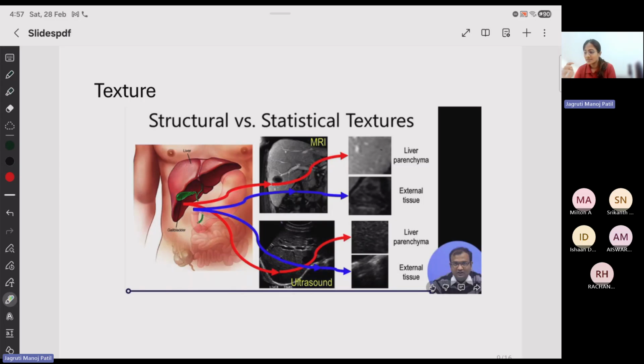Now all of these imaging modalities will conventionally give you grayscale images, right? So everything is in gray levels, in gray color. It's not that you can't change the color bar, but that's how people have conventionally used it, and that's how it is easy for the clinical instruments. Otherwise, if you need to render it in color, you'll need much higher and more complex hardware, so they don't prefer it that way. And how they differentiate is through different levels of echogenicities that you get in the image.